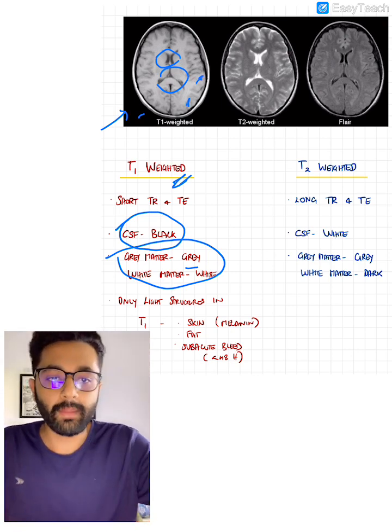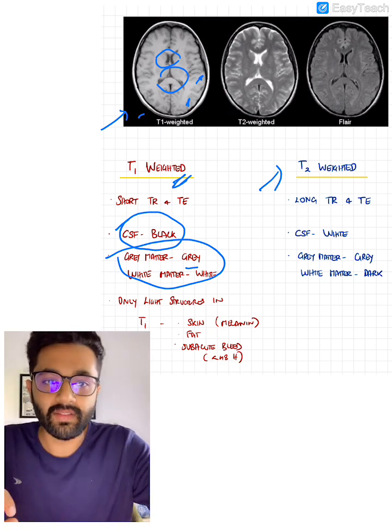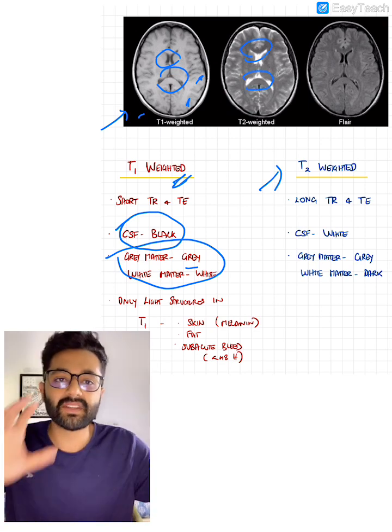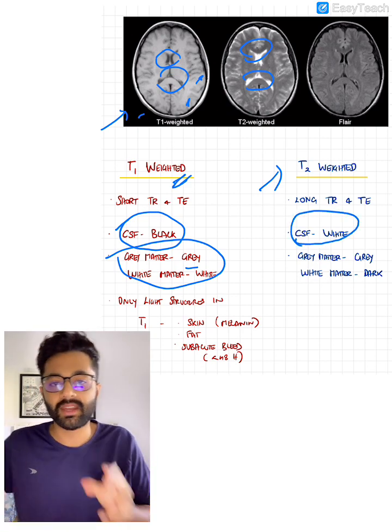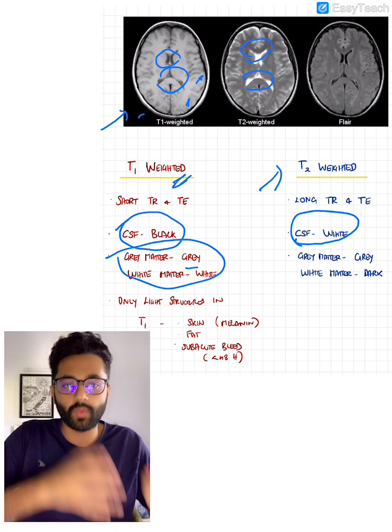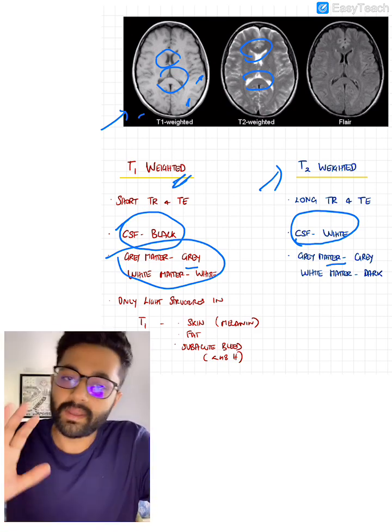Now coming to T2 weighted image, you can see here the CSF filled spaces or the CSF is white in color. So in the T2 weighted image, the CSF is white. So this is the easiest way to differentiate: CSF is black in T1 and CSF is white in T2.